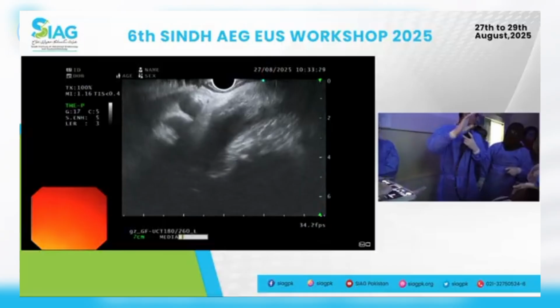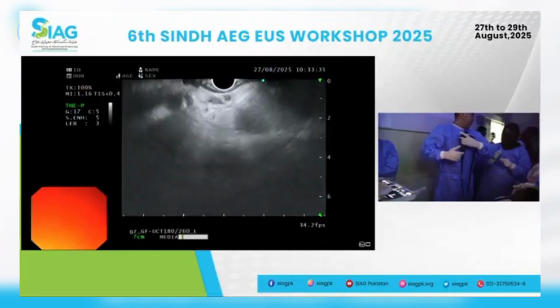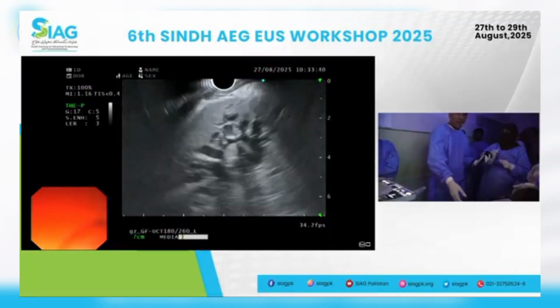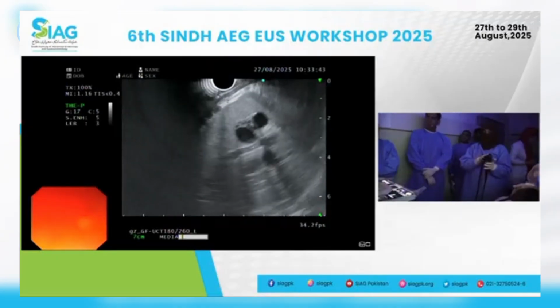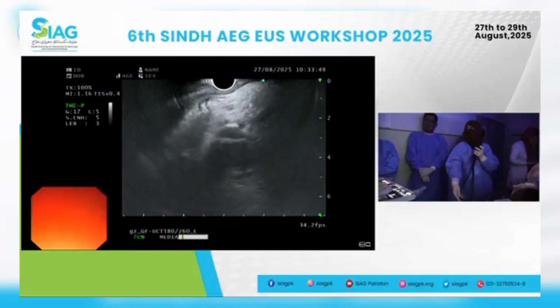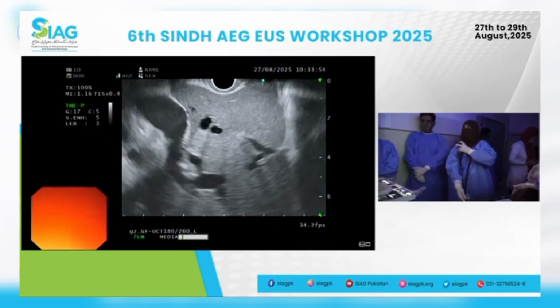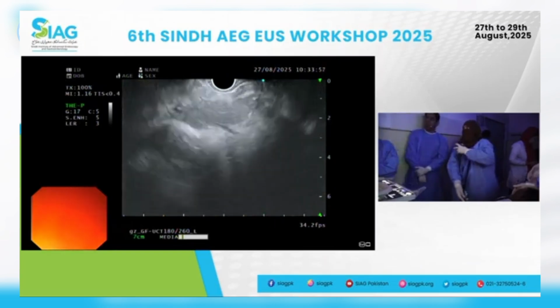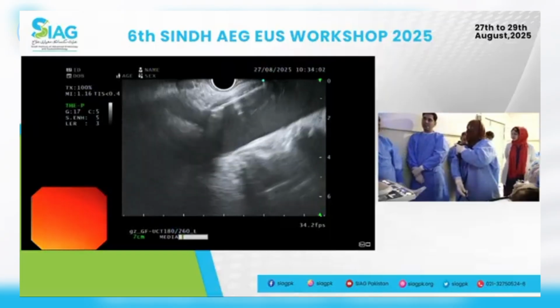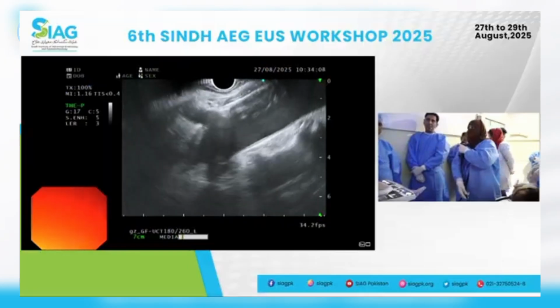Now my scope is pretty relaxed and even here it's free, my right hand is already free. So you move your shoulders first, because if you move this way you're already in a bit of a tricky position. Okay, so let's just see if we can go back, let's see if we can reproduce that image. So the left lobe, suction, tip up. Good. Keep going to the right. Good, very nice, well done, excellent. So celiac axis, diaphragm crus. Good, okay.